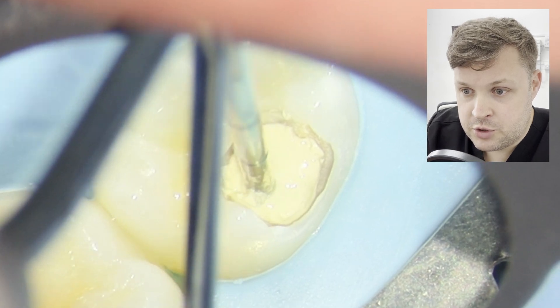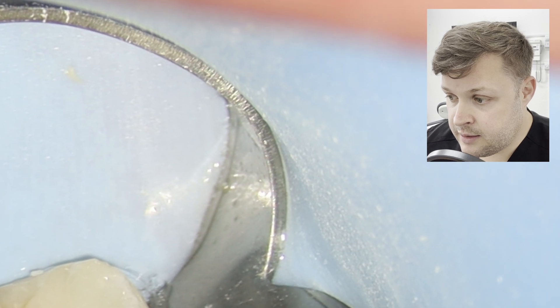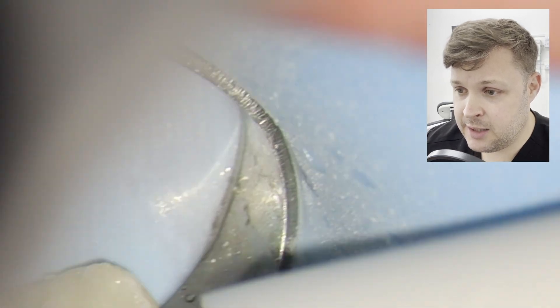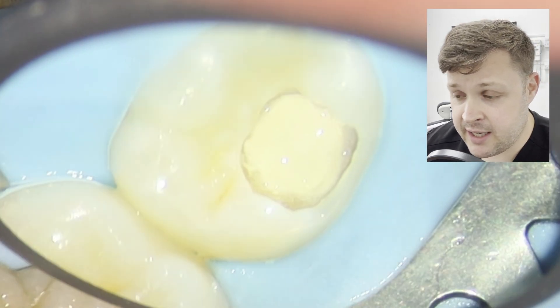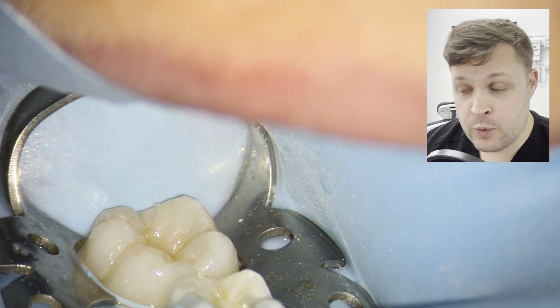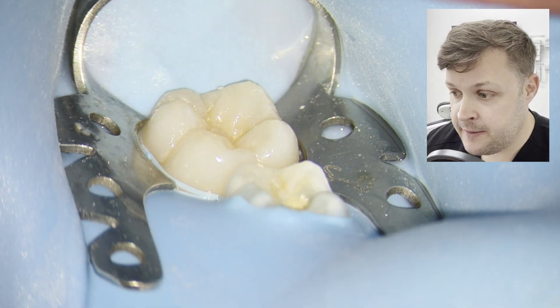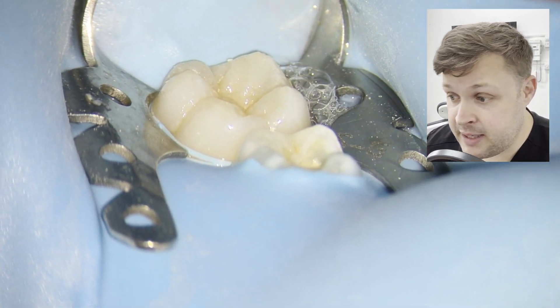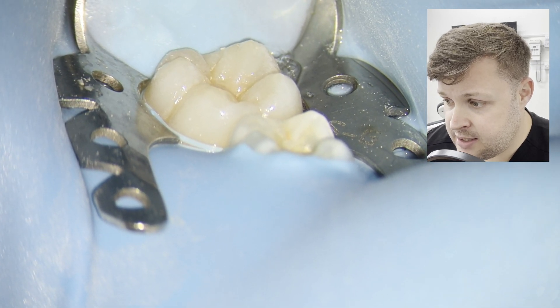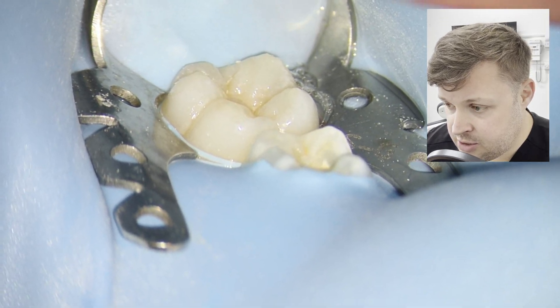I'm very gently checking the cavity. You can't always see the pulp directly, but often you can see it shining through the dentine — that's where you want to place the bioceramic. Here I'm blowing a very gentle mist of water into the cavity; the bioceramic and moisture together help it set quicker. You don't want to flood it, just make it slightly moist, then wait 15 minutes for it to set.